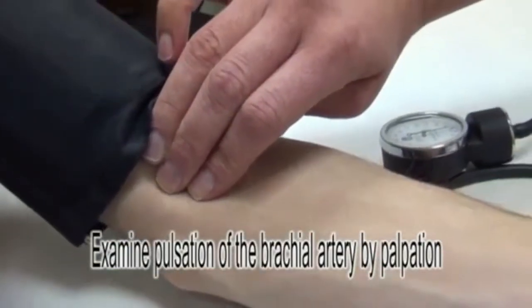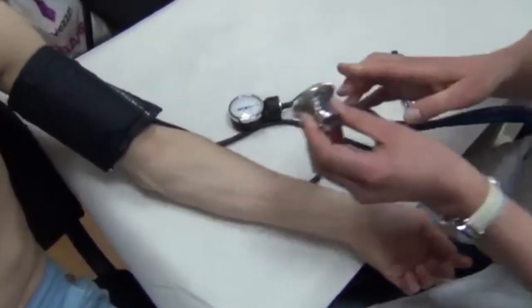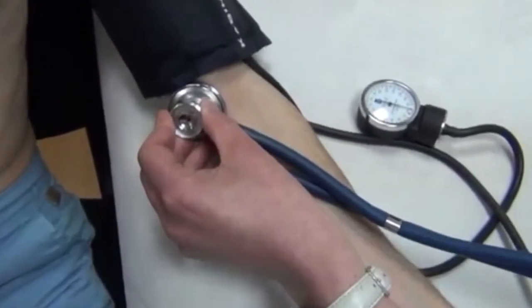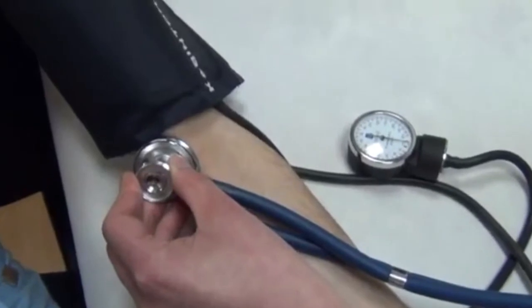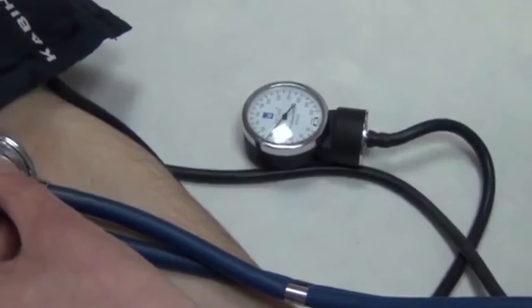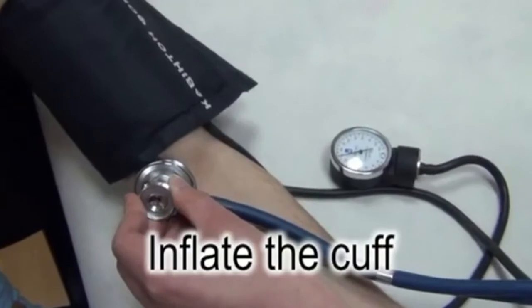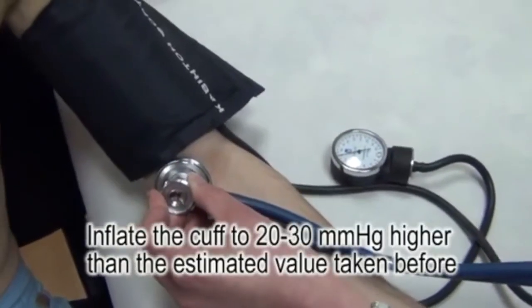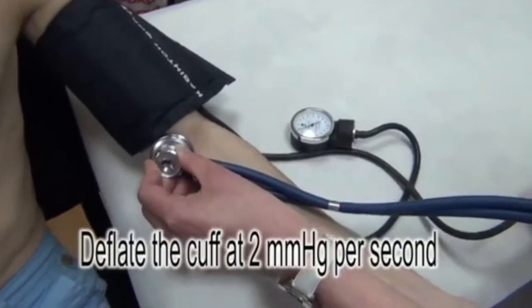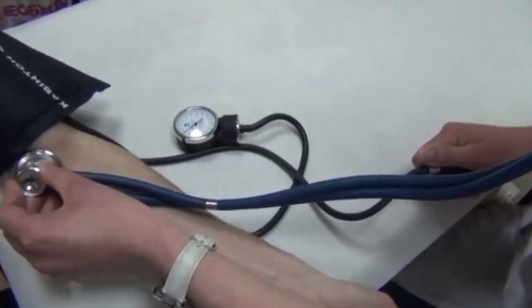After 2-3 minutes of rest, we find the pulsation of the brachial artery by palpation. Over the place where we found the pulsation of the brachial artery, we place the stethoscope. We start to insufflate the air into the cuff — quickly up to 80 mmHg, then slowly up to the level found by palpation plus an additional 20-30 mmHg.